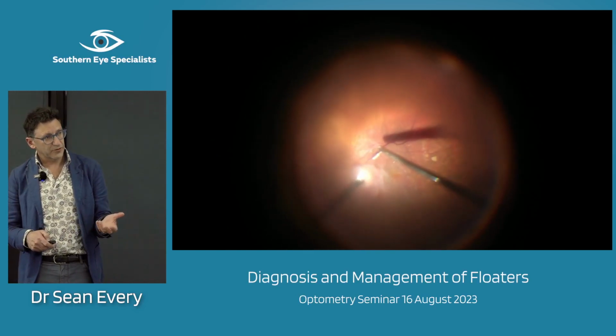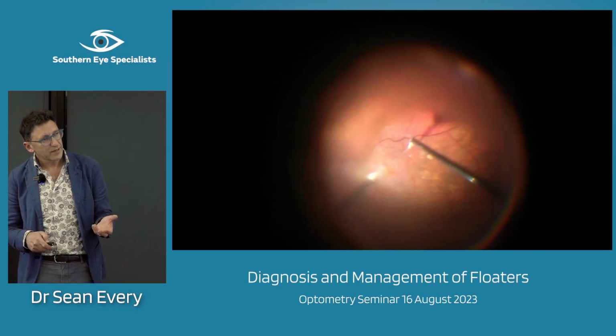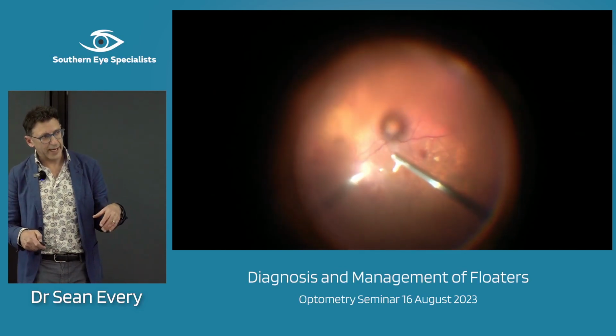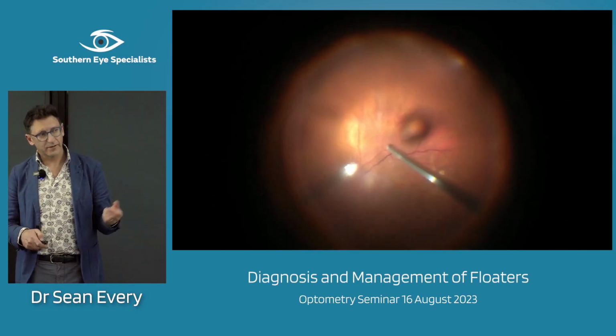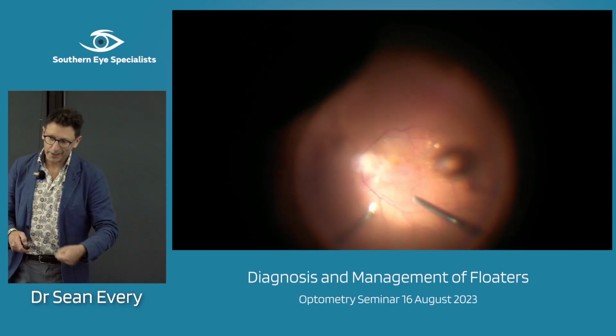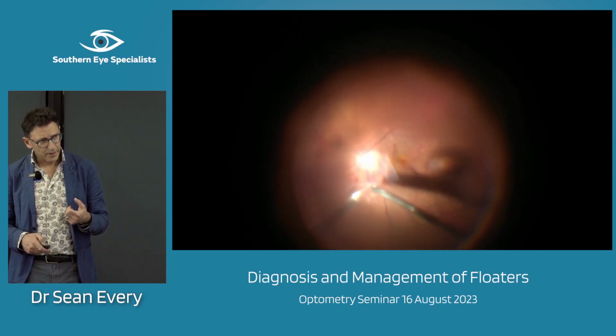So this is the bit. It's not a big deal at the posterior pole, but you'll see this tension line. See that tension line there? Just rolling across there? And so that's separating the posterior hyaloid away. And that is the event. The tears only happen in the peripheral retina, but when you're stripping it right out into the periphery towards the vitreous base.